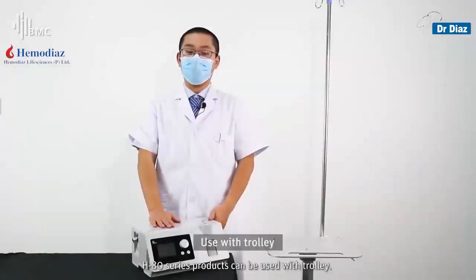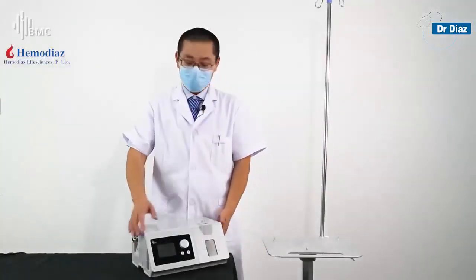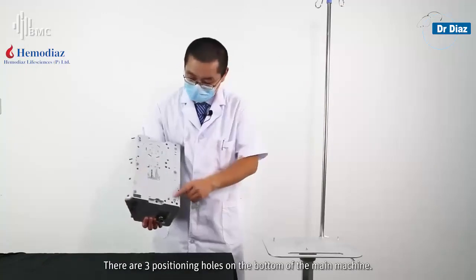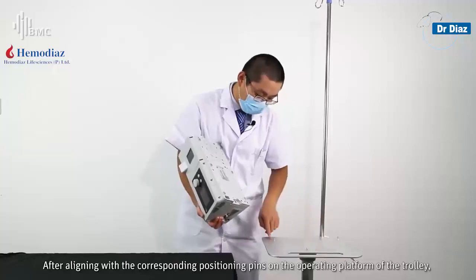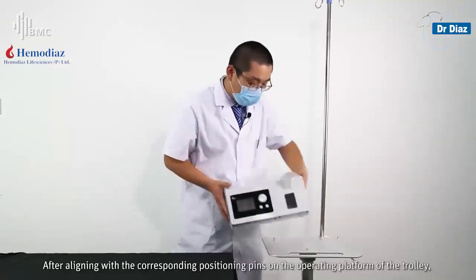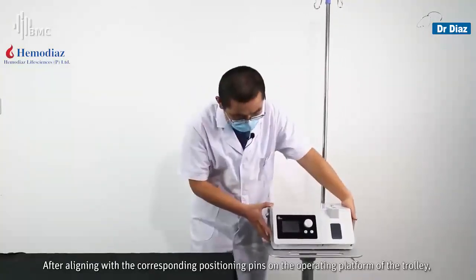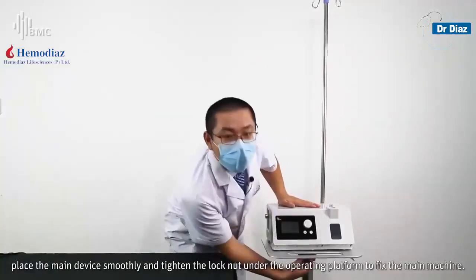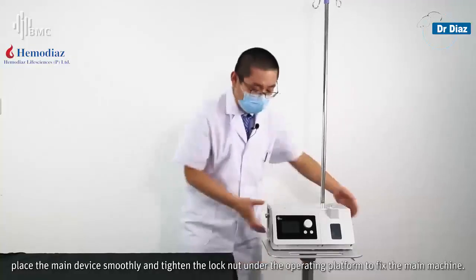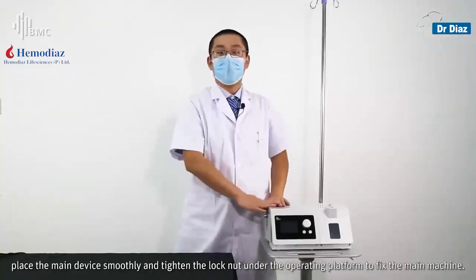H-80 series products can be used with a trolley. There are three positioning holes on the bottom of the main machine. Align them with the corresponding position pins on the operating platform of the trolley, place the main device smoothly, and tighten the lock nut under the operating platform to fix the main device.